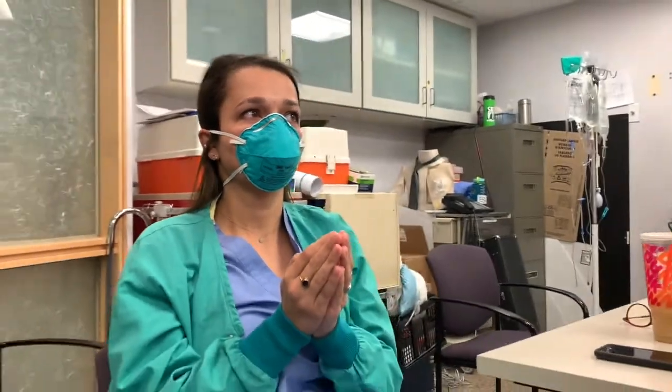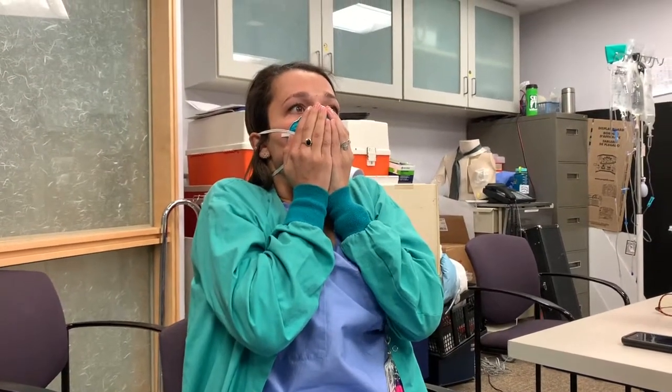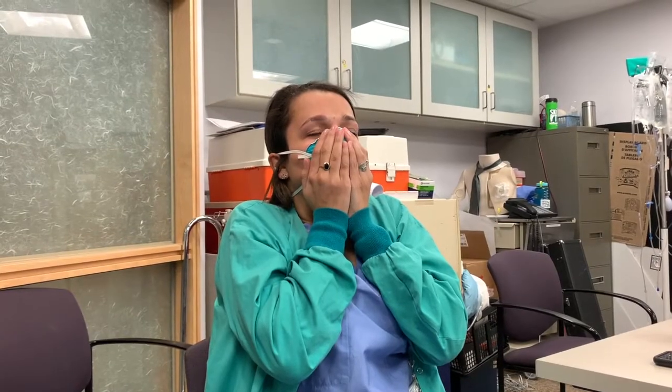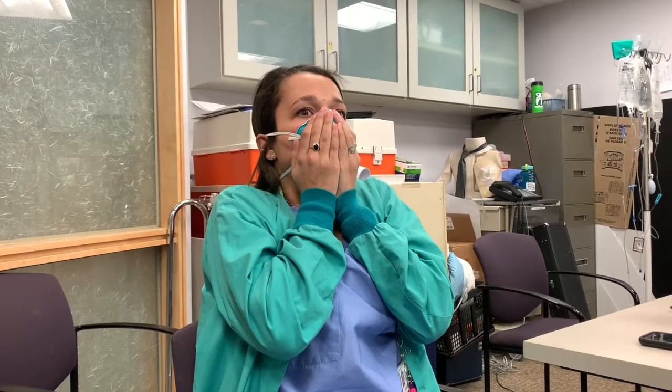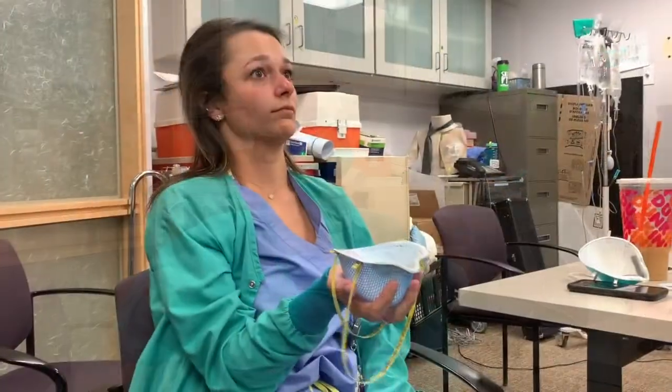Once your straps are snug, place your hands over the mask again and breathe in for negative pressure. You may feel the mask pull in a little bit. As long as you don't have air escaping by your eyes or face, the seal check is complete and you can wear that mask.